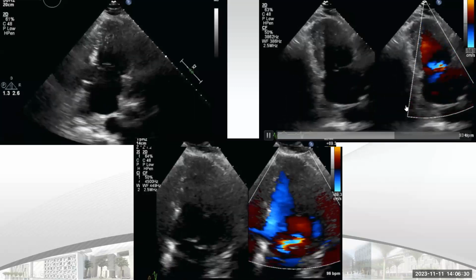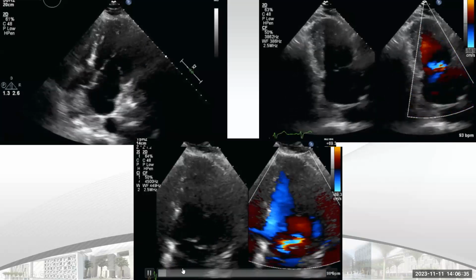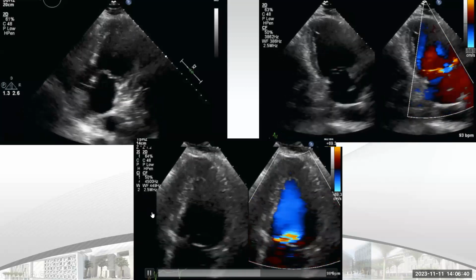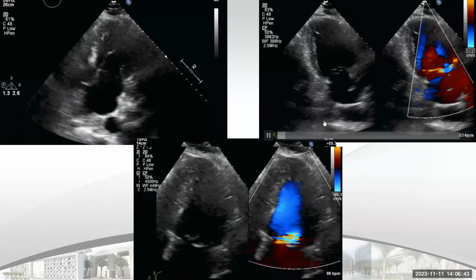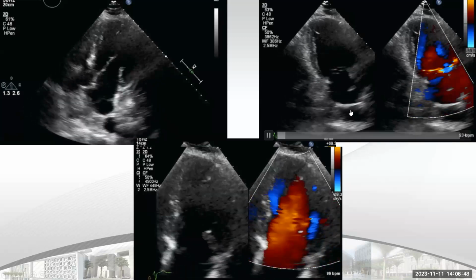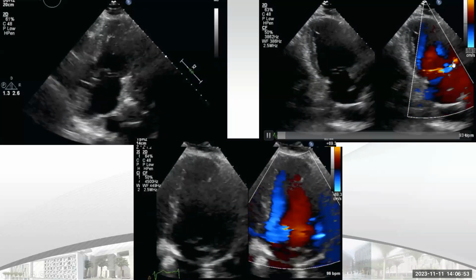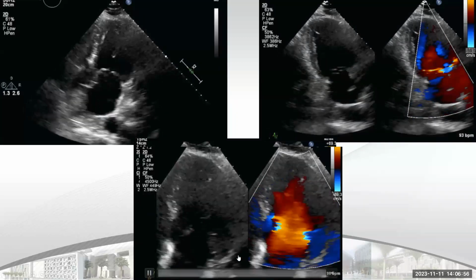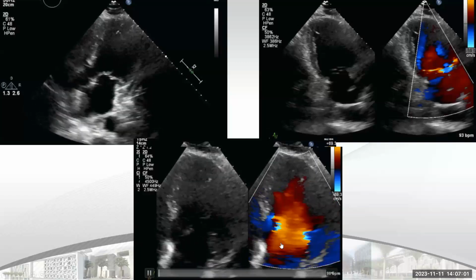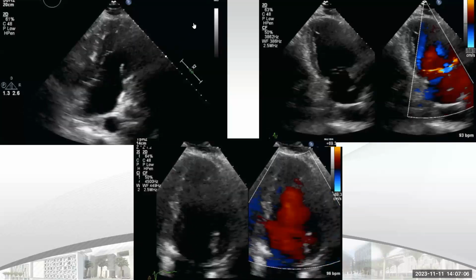you may think the size of the jet inside the atrium is small, but we have a very good sign, rarely seen unless you're doing echo. This is called the splay sign. What do I mean by splay sign? In case of severe regurgitation of the mitral or tricuspid valve, the MR jet will not go directly to the left atrium, it will go very horizontal, like here. This is called the splay sign, usually a sign of severity. This is well studied, as you see here. It is also very eccentric, and this means severe mitral regurgitation.